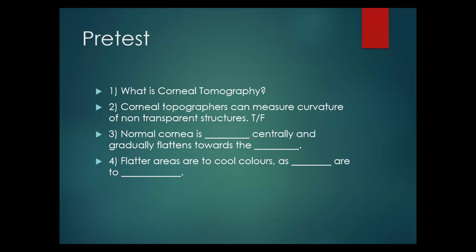So one more thing, Dr. Osazee, the definition of this corneal tomography can come in various forms. I hope we also look at it, and not only the definition you gave. So think about it as well, because from what we know about tomography, it applies to something other than what you presented in your response. I'm just drawing attention to it. You could share it with the house so that we can know what you mean.